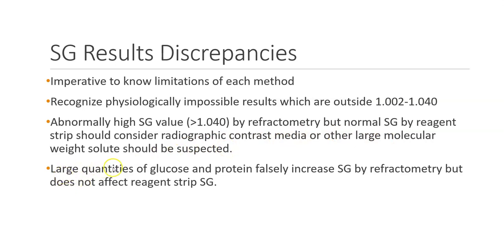Also remember that large quantities of glucose and protein falsely increase specific gravity by refractometry, but do not affect the reagent strip specific gravity.